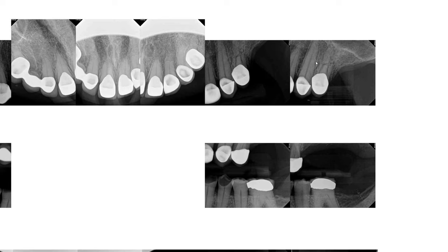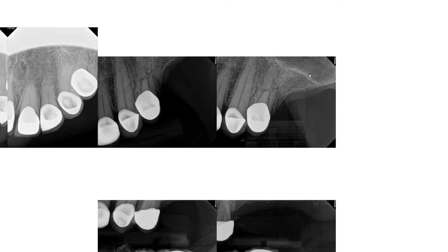So let me zoom in and look at this periapical radiograph more carefully. You can see the overall shape of the root of the first premolar. There's a thin radiolucent line that is extending from the mesial side all the way to the distal surface of the root.